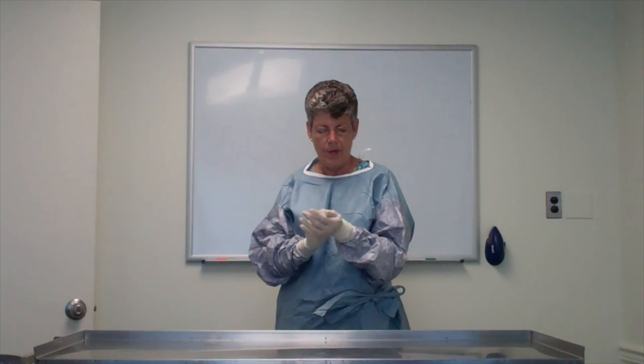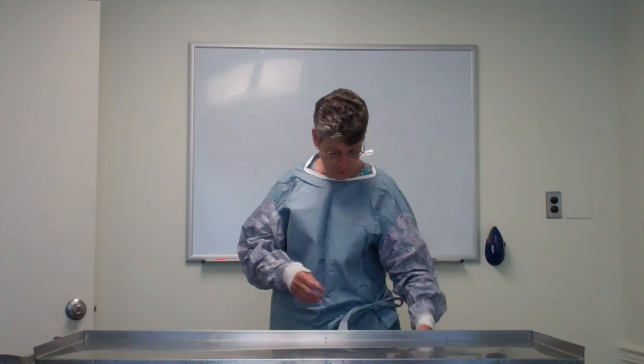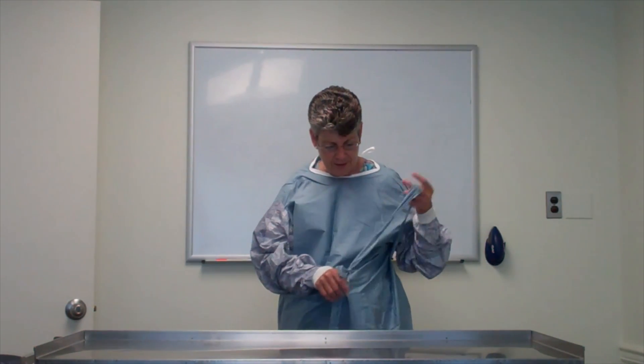Alright, so now you didn't feel quite comfortable putting this gown on and you want to practice some more. So I'm going to show you how to refold your gown so that you can do this over and over numerous times. The thing that you don't want to do if you're going to refold the gown is you don't want to break these ties.